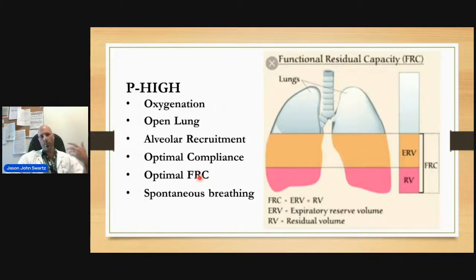You're getting alveolar recruitment of those stubborn alveoli, where perhaps it's not only about a certain pressure being exerted, it's that pressure over time that is the magic. It's not only about pressure. We know recruitment is pressure over time, and we know in conventional modes your inspiratory time is often limited to 0.6 to maybe 1 second.